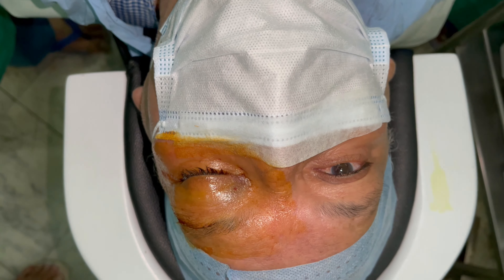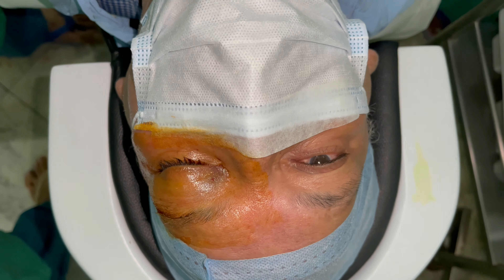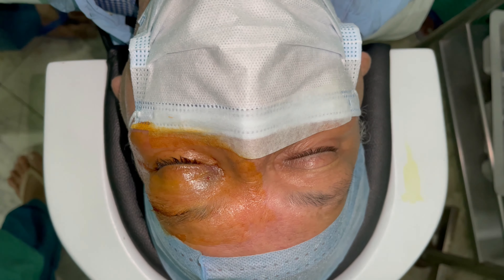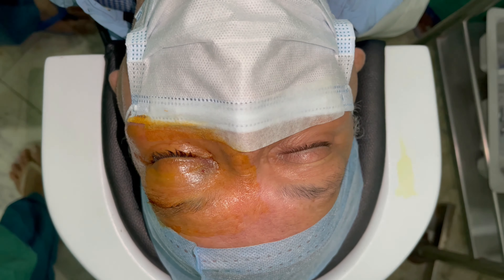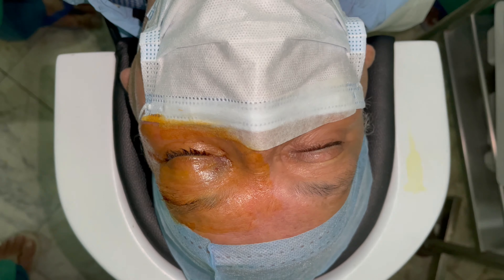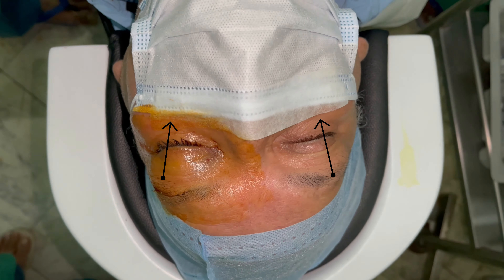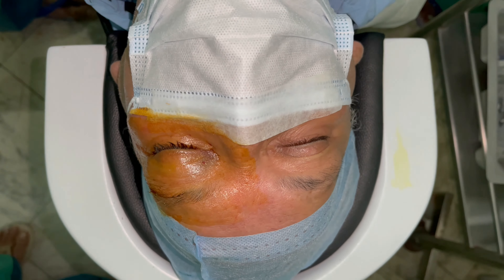The following video aims to depict the ideal technique of draping the eye. With COVID times, we take extra precautions: the mask that the patient wears is secured to the nose using a micropore tape across the patient's nose. This ensures that whenever the patient is breathing, we don't have air accidentally coming towards the operating field.